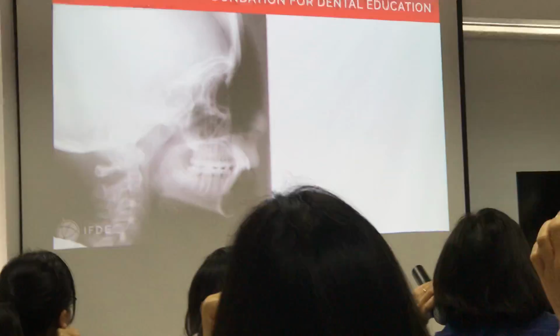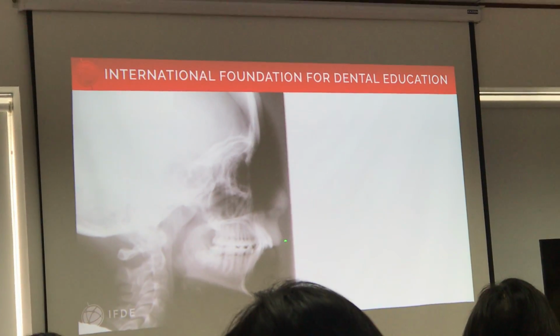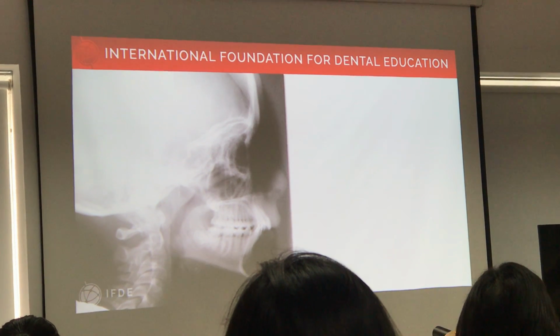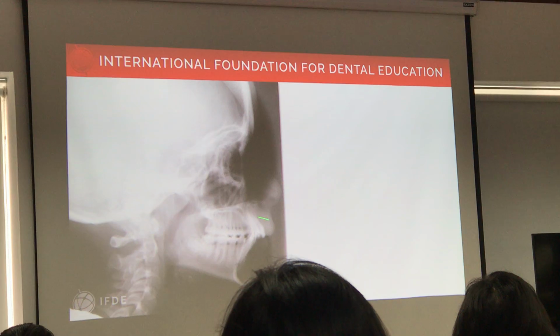So there are a lot of people out there who say that when you use a headgear, you treat the wrong arch because you're pulling this back and the lower jaw is really the problem. It's not true. What we do, we just hold this one a little bit, and you don't want to overuse headgears, by the way. Okay?